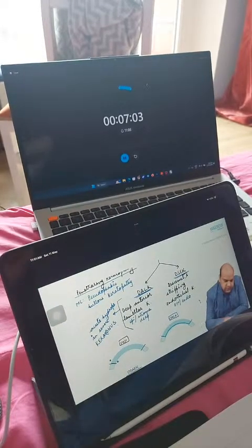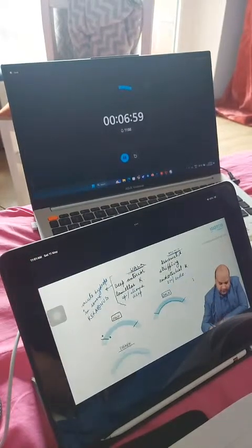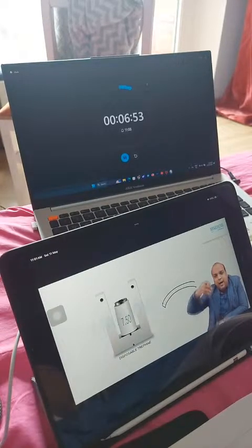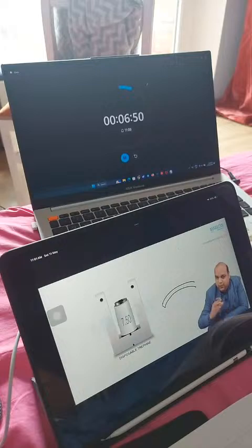Now, once we know the types of keratoplasty, we need to know just a little simple information. How to do keratoplasty, everybody? Let's see this. So basically, let's say this is my cornea. Over this cornea, I have to first cut the host cornea to remove the damaged cornea. So we call this a trephine, everybody. You will be able to see the name written, trephine. This trephine diameter is 7.5 mm as written on the trephine itself.